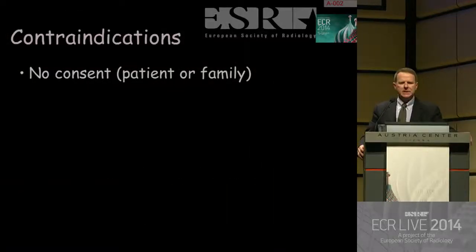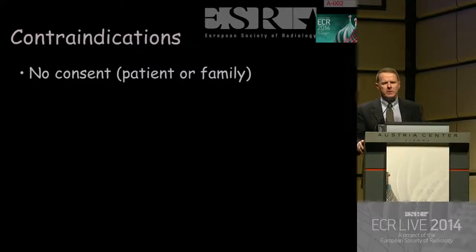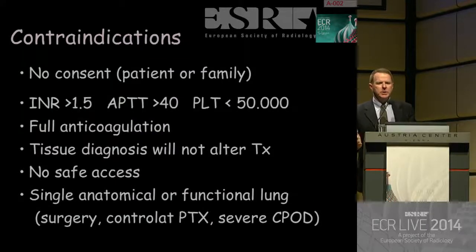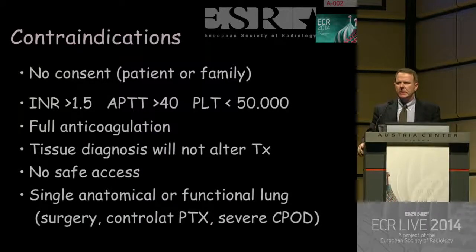Contraindications. Once you have decided that there is an indication for the biopsy and you are going to schedule it, then you go into the clinical part of it. I think that the only real contraindication for lung biopsy is no consent, either from the patient or, if the patient is not able to give consent, from the family. Otherwise, the other contraindications that you see listed here, there are ways to go around that.